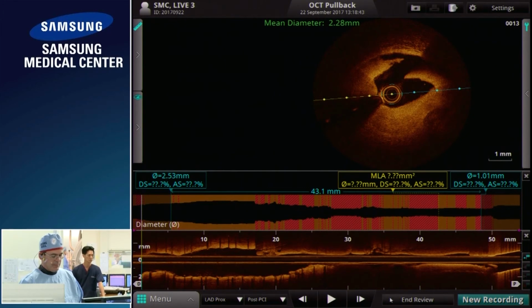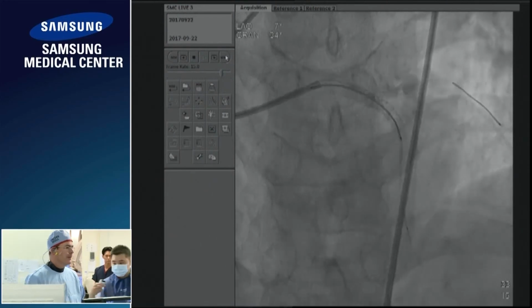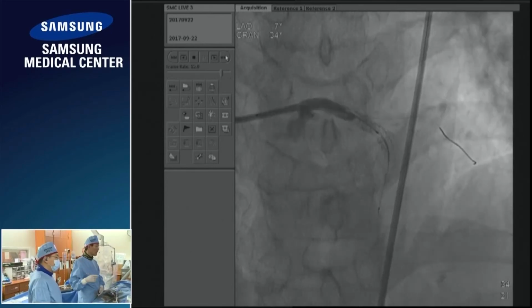While you put the angiography on the screen, please. Okay, next. Next. Next. Down.